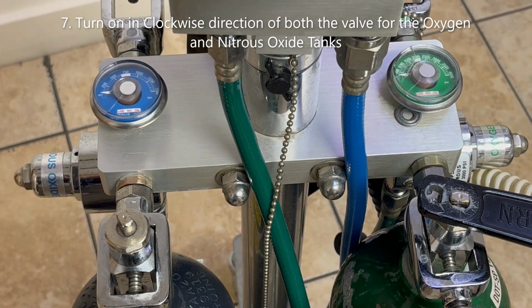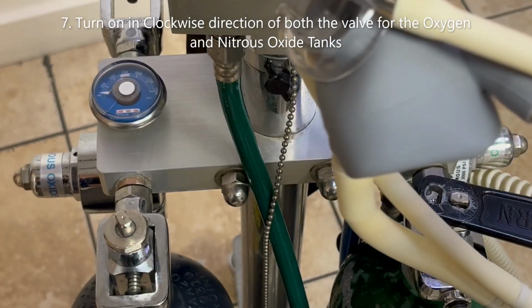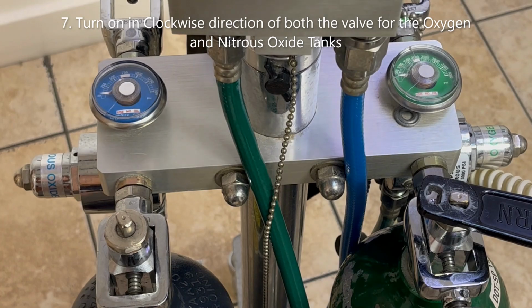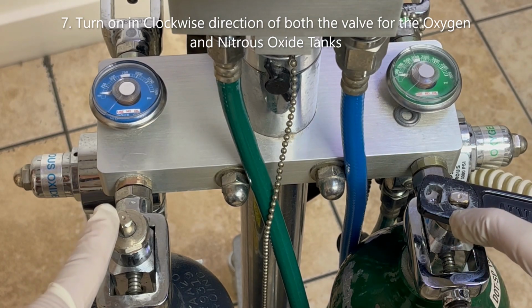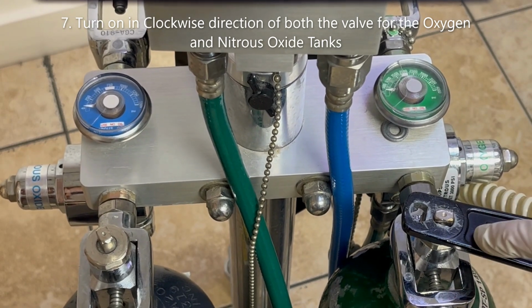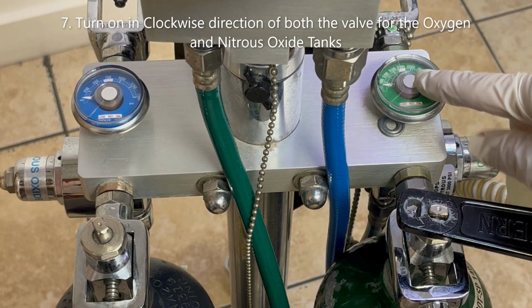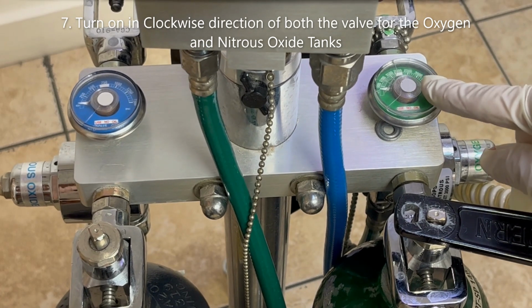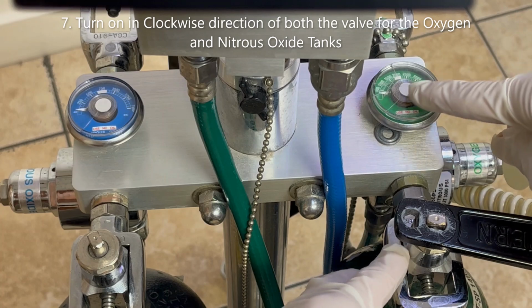Once the nose piece is on the patient, you can come back and turn on the oxygen and the nitrous. Now I want you to pay attention as I turn on this oxygen tank. Keep an eye on the pressure gauge, where the oxygen comes from, and see what it is.